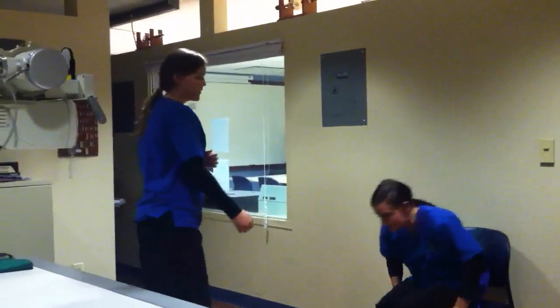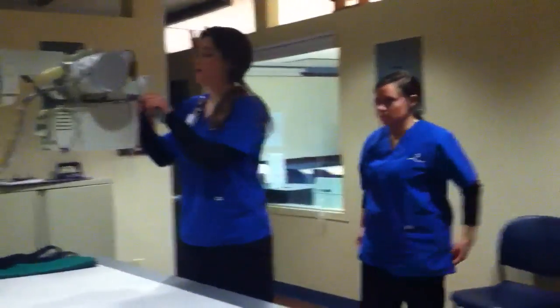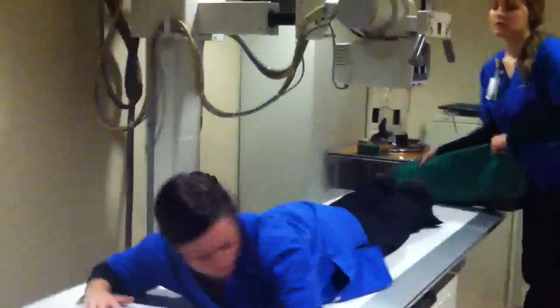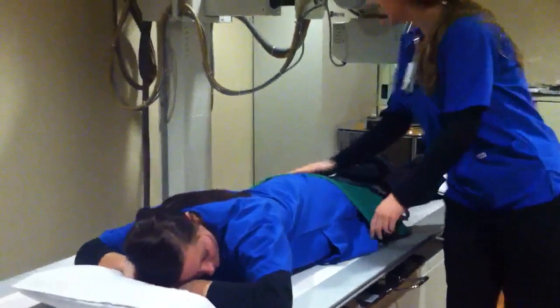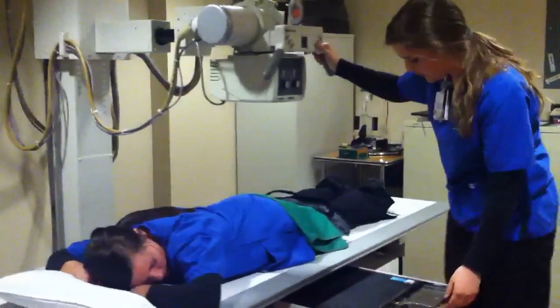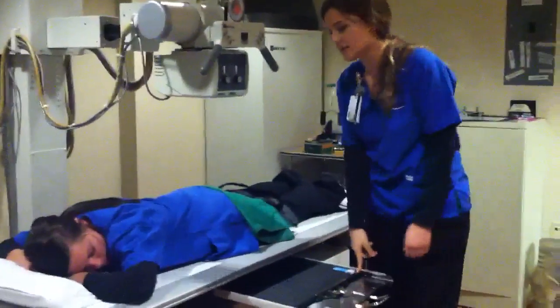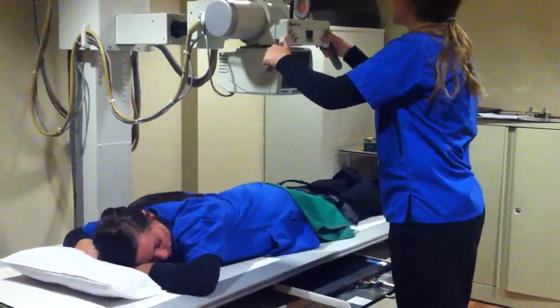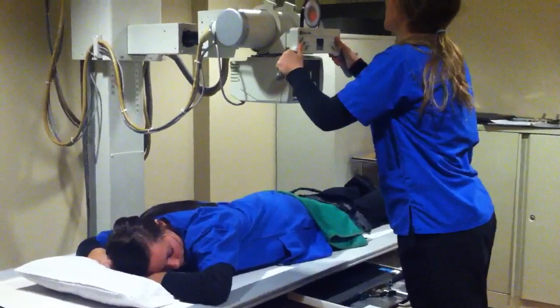After they're done drinking that, I'll bring them into the room. So come up here. And we're going to do a PA abdomen. You can sit here. She's going to lie prone on the table on her stomach. So I have a 14 by 17 cassette in the bucky with a left marker on the left side of the patient. I'm going to line my tube up. Make sure it's incident.